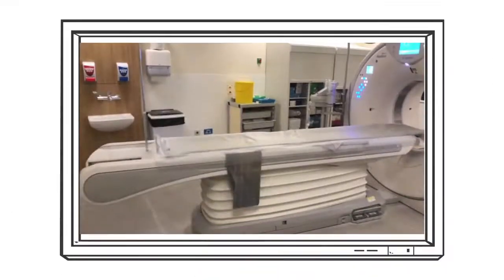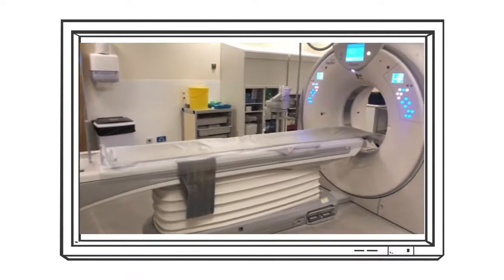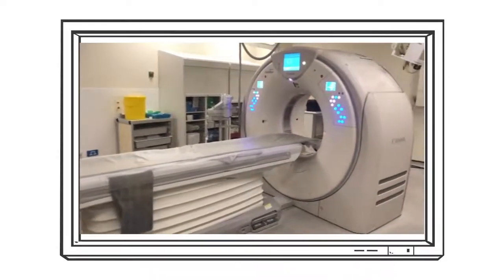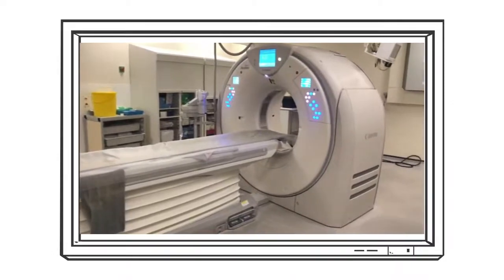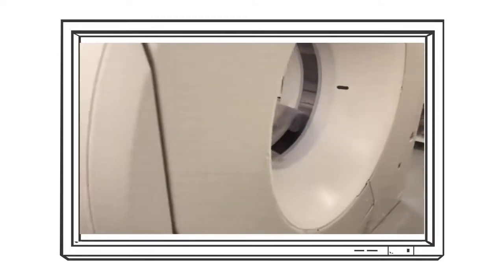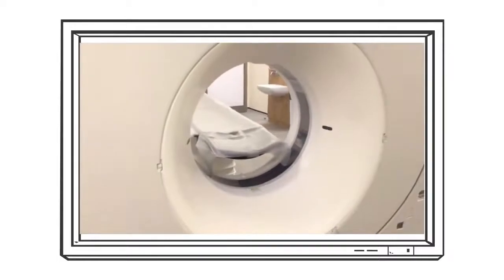As you can see in the video on the screen, the spinning X-ray machine is hidden inside the scanner so that you will not even know that it's spinning. The scanner is also very quiet. If you've had a scan in the past and it was loud, this is more likely to be an MRI scan, which is a different type of imaging. The radiographer will sit outside the room during the scan, but will be able to see and hear you throughout.